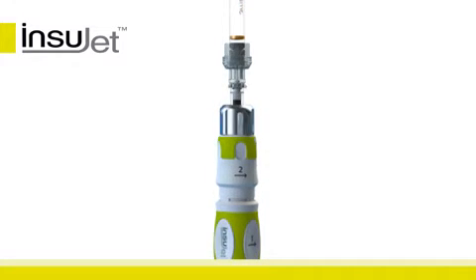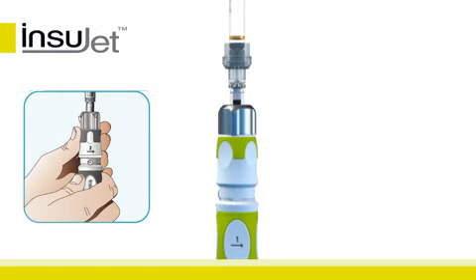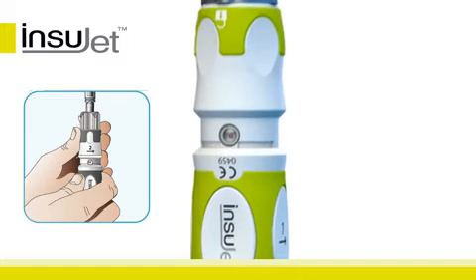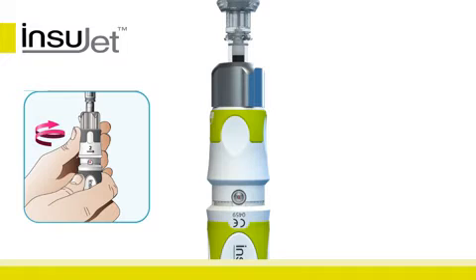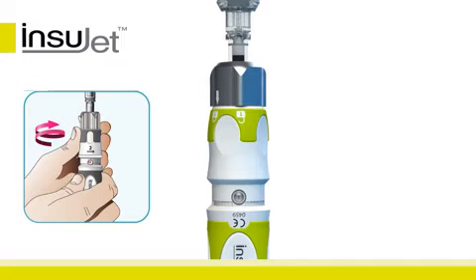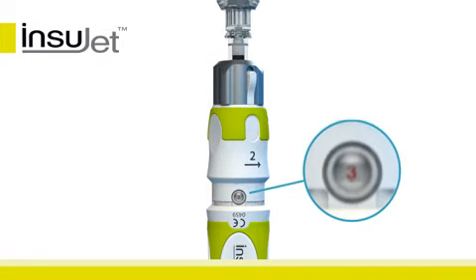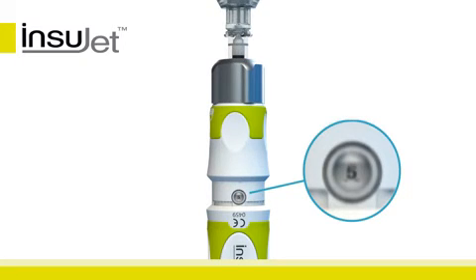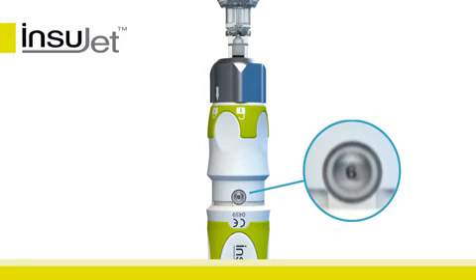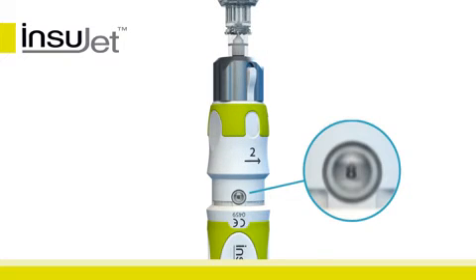Now we're ready to take up the insulin. Hold the Insujet vertically with the insulin cartridge upwards and the dose window facing you. While keeping the back of the device stationary, rotate the top of the device in the direction of the number two arrow. Numbers will appear in the dose window indicating the amount of insulin units taken into the nozzle. For each unit taken in, you will notice a notch. Always take in some extra insulin to compensate for possible air bubbles.